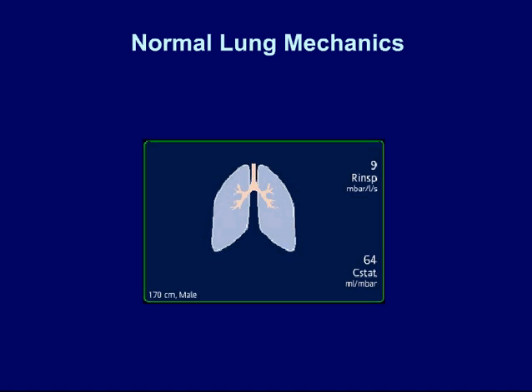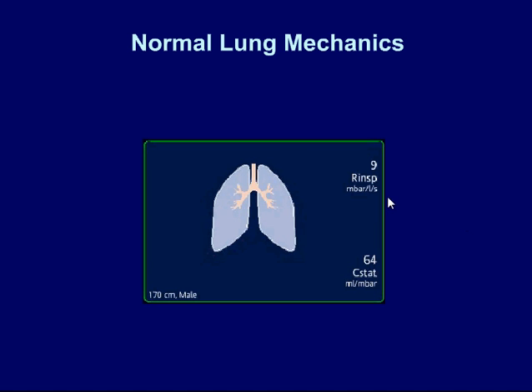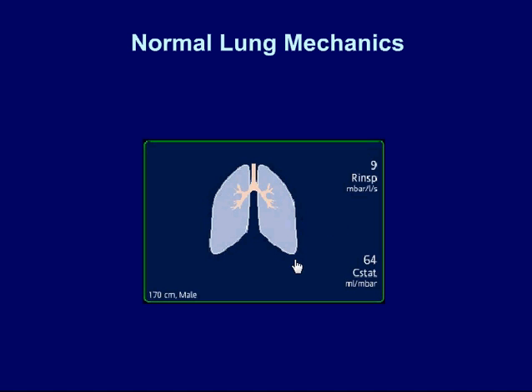Here's an example with a patient with normal lung mechanics. As you can see, the resistance line and the compliance is 64. The bronchial tree is nice and pink and the lungs look normal.